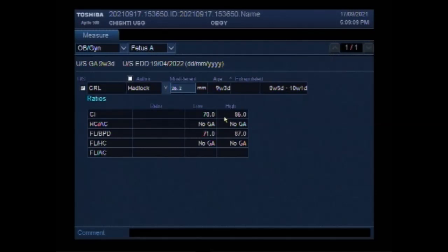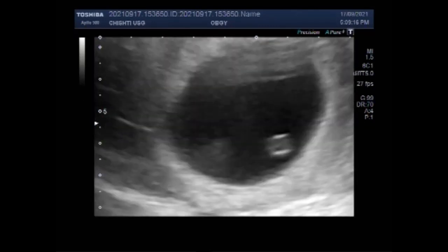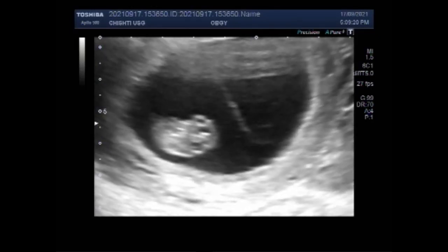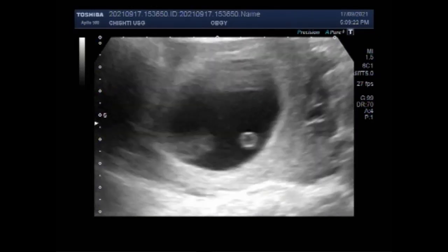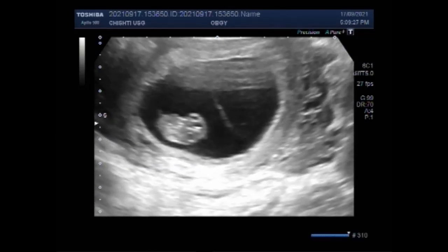This ultrasound video shows two sacs with one fetus, with pregnancy of about 9 weeks. You can see the uterus having a gestation sac, two gestational sacs. These are the two gestation sacs, and this is the intertwin membrane that separates the two gestational sacs.